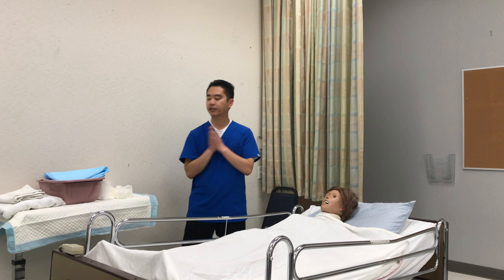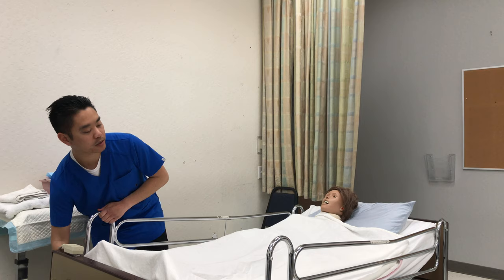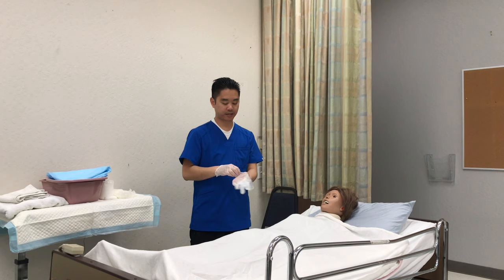I'm gonna grab my supplies. Now that I'm back in the room, I'm gonna wash my hands again and close the curtains. I'll adjust the bed to a comfortable position, lower the side rail, and put on my first set of gloves.